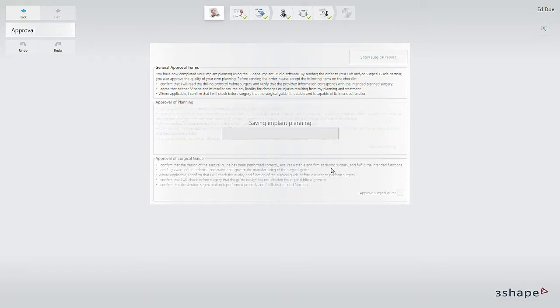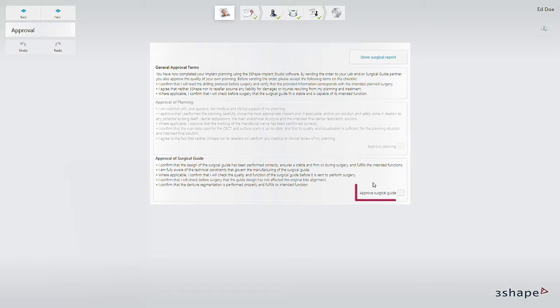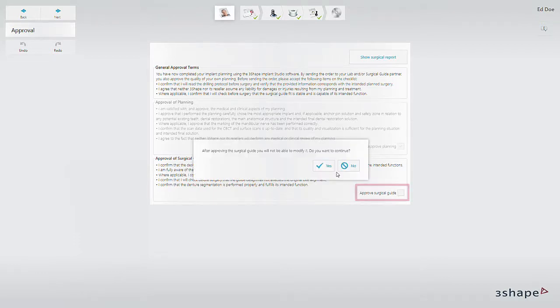With the implant planning approved, you can go on to approve the surgical guide. Once again you need to click yes to acknowledge that you cannot change the guide once you've approved it.